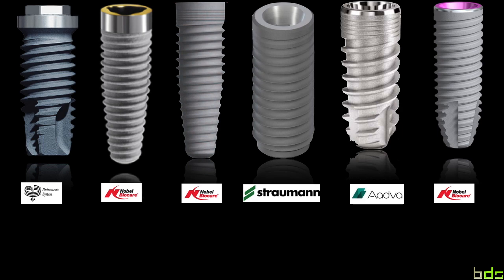And then later on, the Nobel Select system came in, which has a highly polished collar, the first 1.5 millimeter, and a rough surface. Then about in the years 2007, 8, 9, 10, the trend was to go towards grooviness and roughness to the top to preserve as much bone as possible, micro-threading.